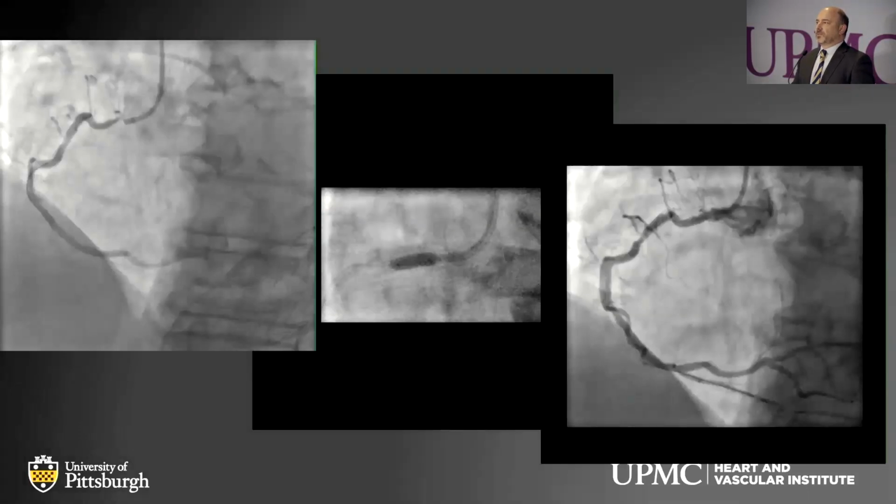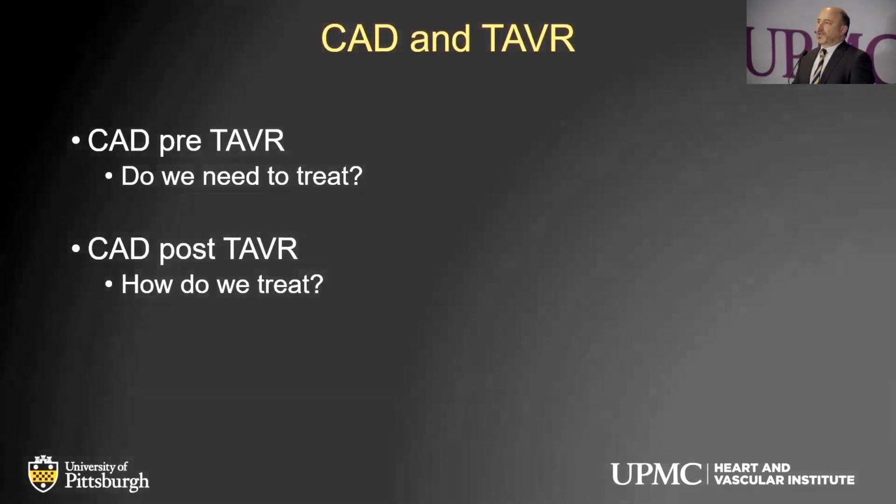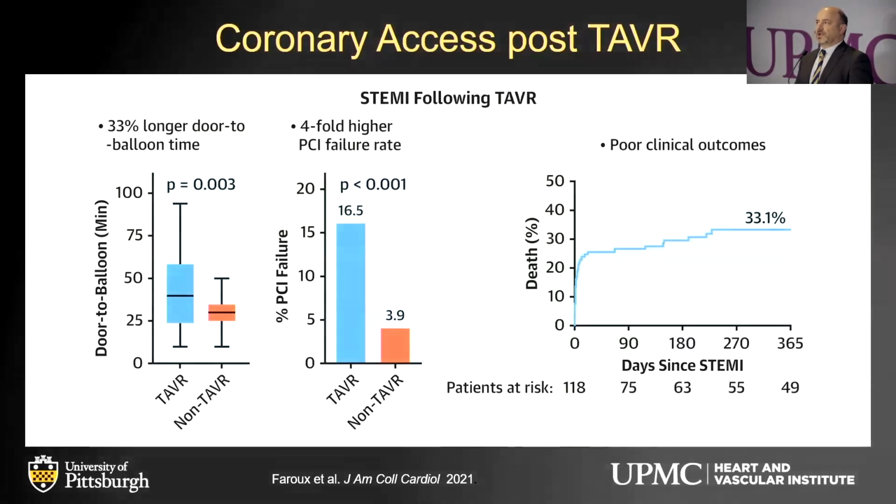So this is back to our patient. I think we might have used Shockwave on this patient, and we got a good result. So how about coronary artery disease post-TAVR? This becomes more of an issue of how do you do this, and what are the technical challenges here. There are a number of studies looking at coronary access post-TAVR. As you can imagine, it's a little challenging.